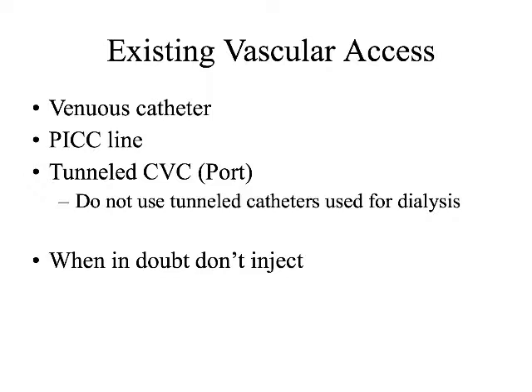A tunneled CVC or port. Has anyone yet been to OR to see port access stuff? Or has anyone seen a cancer patient who has a little bulge right here on their chest? That is a port. Those are placed surgically, and they can be accessed with a kind of a crooked needle like this that's hooked into the skin, right? A lot of times they'll numb up the skin or something prior to access.